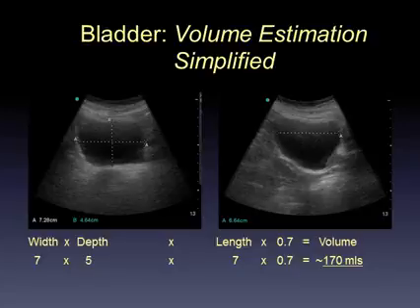Of course, arithmetic can be challenging at the best of times, so I offer here a simplified method, in which you just round the measurements you've taken appropriately to one significant figure, multiply that together, and then add a corrective factor of about 0.7 or maybe 0.75. It won't be out by more than a couple of tablespoons to the slightly more detailed approach.